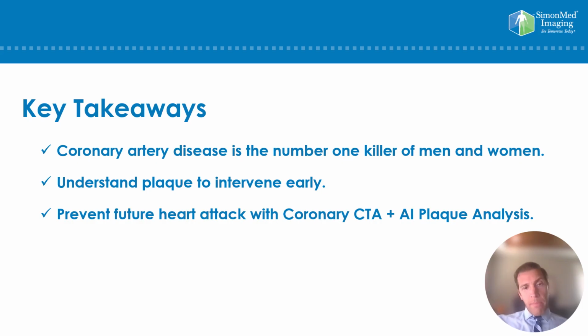So remember, coronary artery disease is the number one killer of both men and women. I think if we have a better understanding of the plaque that's building up inside our arteries before we develop symptoms, that gives us and empowers us to put together a very personalized management plan and ultimately prevent a heart attack or a stroke or cardiovascular death down the road. So this is a preventive tool that allows us to really understand what's going on inside our heart to prevent a future adverse event.